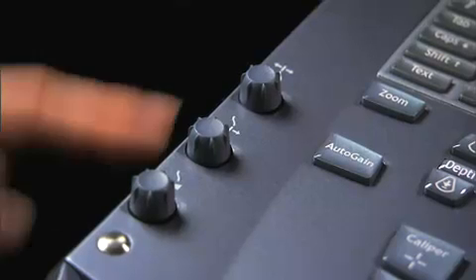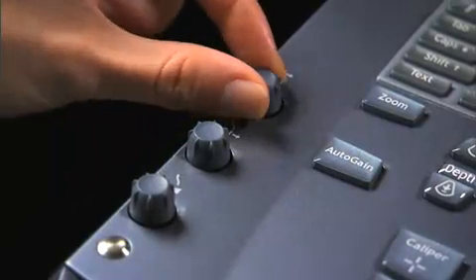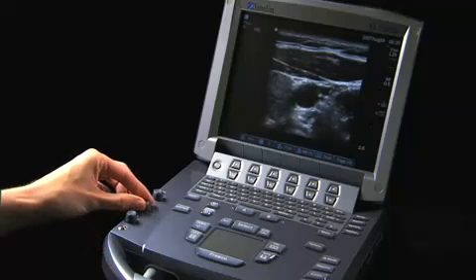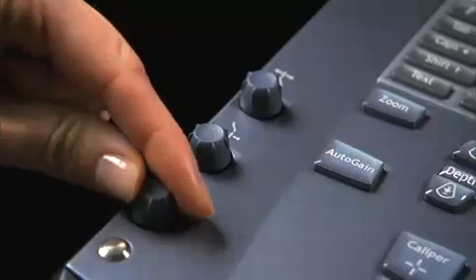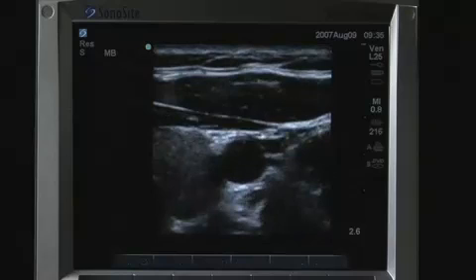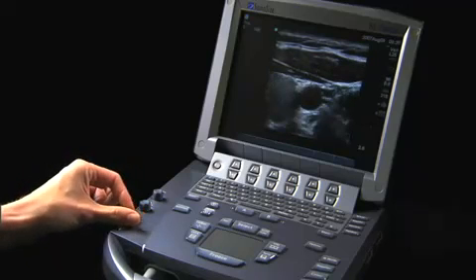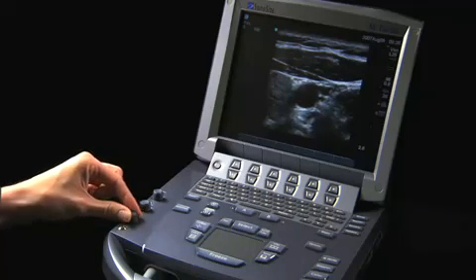On the left-hand side, there are three controls for gain compensation. Near adjusts the gain applied to the near field of the image. Far adjusts the gain applied to the far field of the image. Gain adjusts the overall gain applied to the entire image. When an image is frozen, the gain knob can be used to review images in the CineBuffer — counterclockwise and clockwise rotation scrolls backward and forward through the stored images.